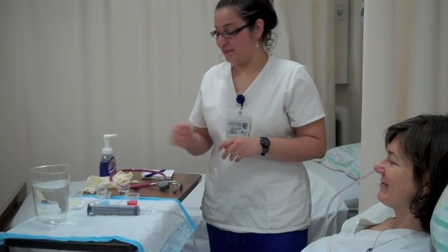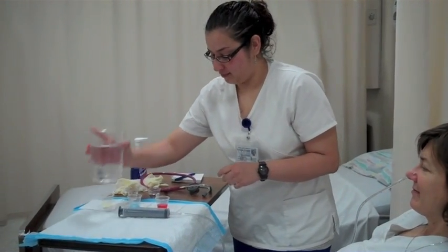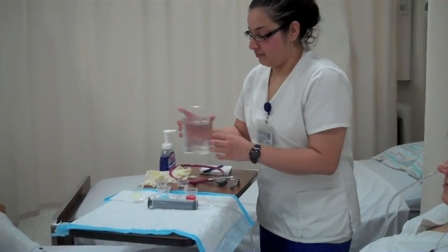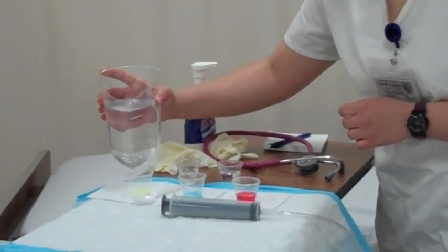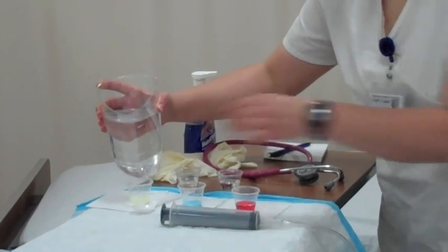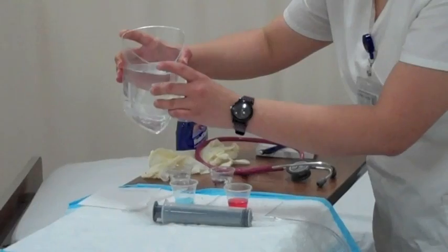Step 3. Preparing the medications. For pills, use a pill crusher. Crush each pill one at a time. Dissolve the powder with water or other recommended liquids, keeping each medication separate from the others.